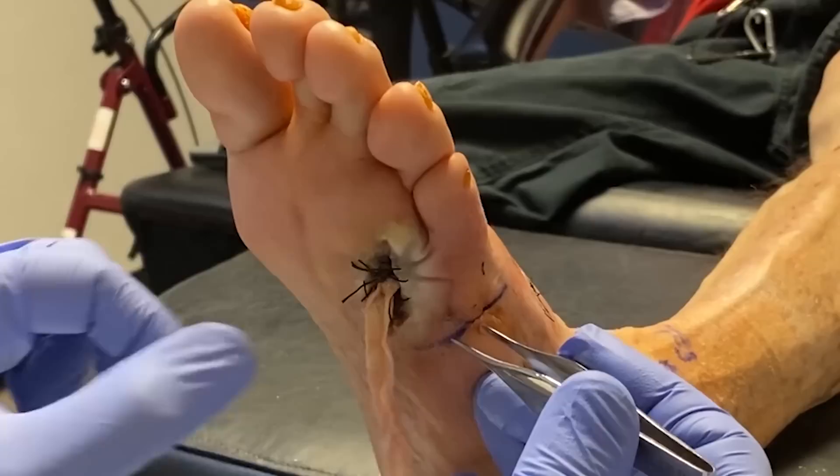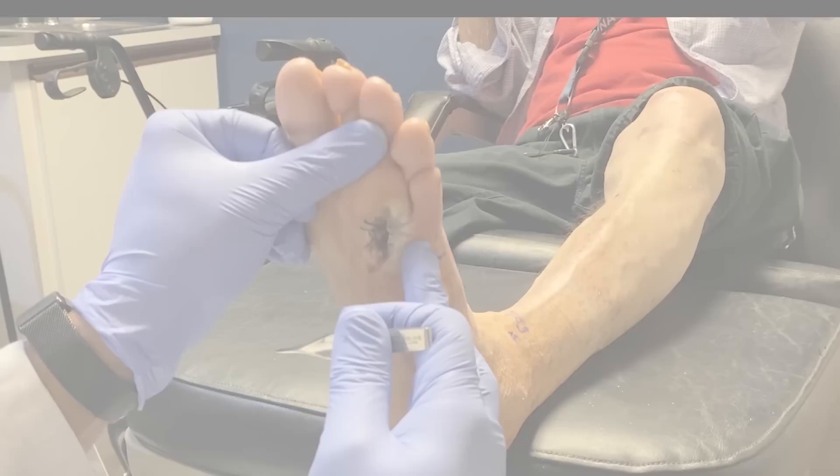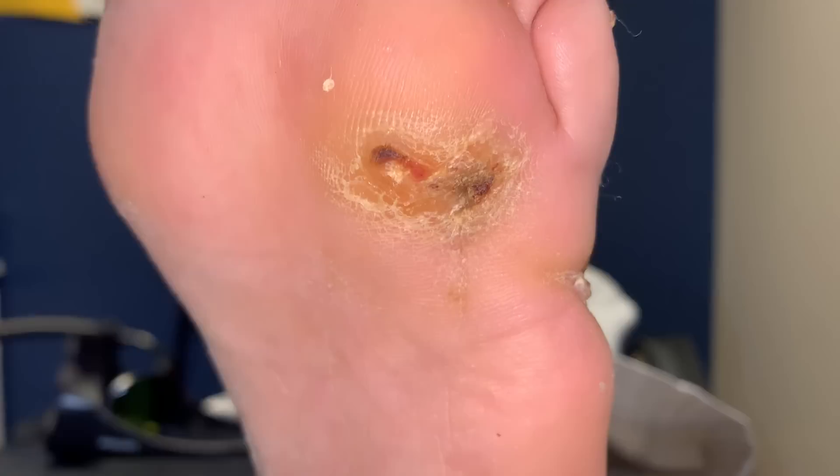This is in the office. I'm basically pulling out the gauze about a week after his surgery. You can see the whitish type of soft tissue reaction around it — that's basically from a lot of drainage. We're going to leave those stitches in for a little bit and take them out later. And essentially, this is what he is looking like three months later — before debridement. His wound is pretty much healed, but I'm going to debride it down a little bit further.